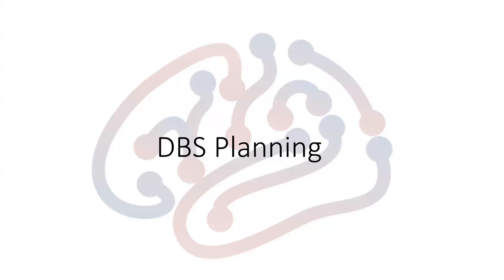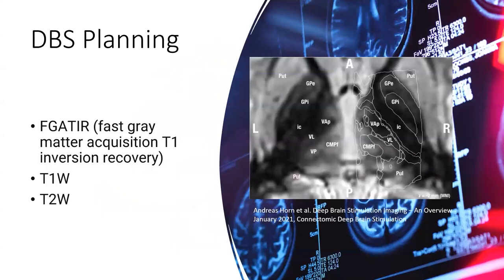Today I'm going to show you DBS planning using DSI Studio. The data we are going to use could be FGATIR, could be T1 or T2 image. As long as we have a structural image, DSI Studio could use it for planning. You don't necessarily need to have a DWI, which is for fiber tracking. For DBS, DSI Studio will only take a structural image.